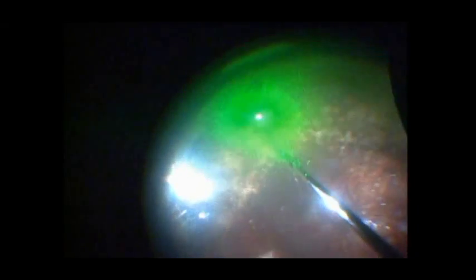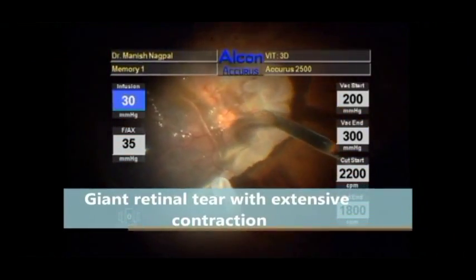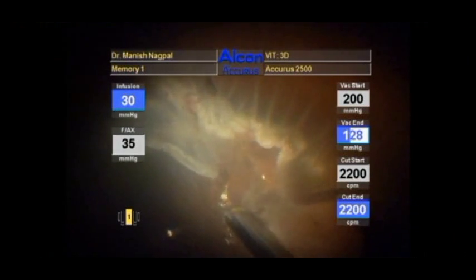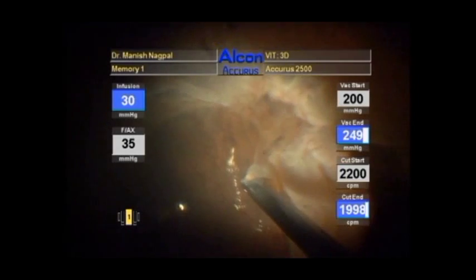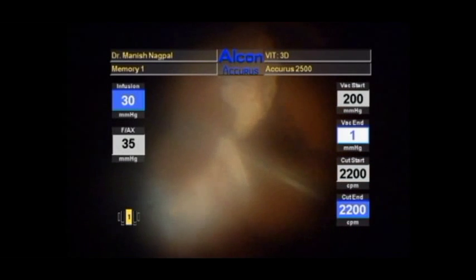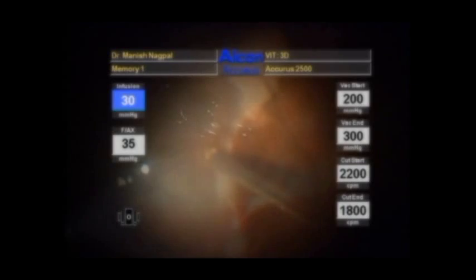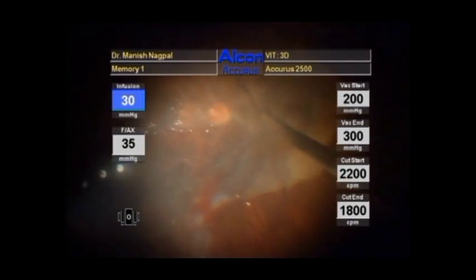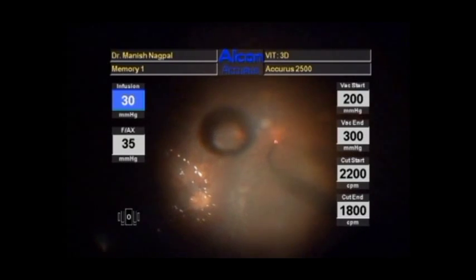This is a case of giant retinal tear with extensive retinal stiffening. Once again, a thorough vitrectomy is done. Minimal PFCL is injected up to the edges to relieve the traction. Traction is identified and a radial retinectomy is done to relieve the same. Residual folds on the retina are ironed out with a spatula. Once the retina is flat, a 360-degree endo laser barrage is carried out.